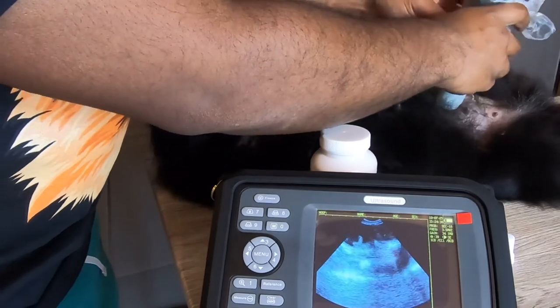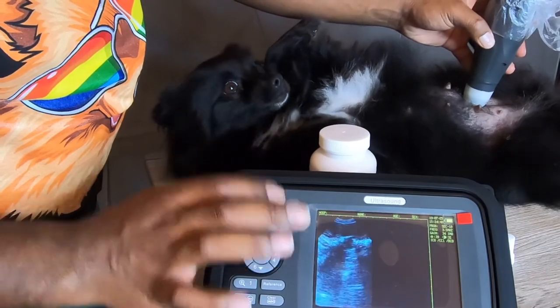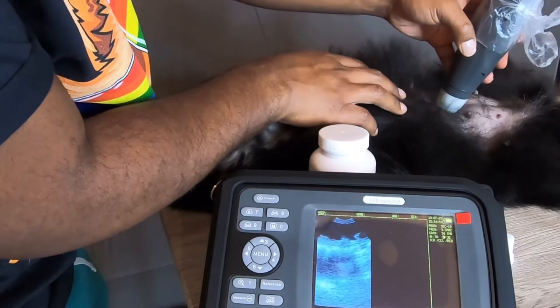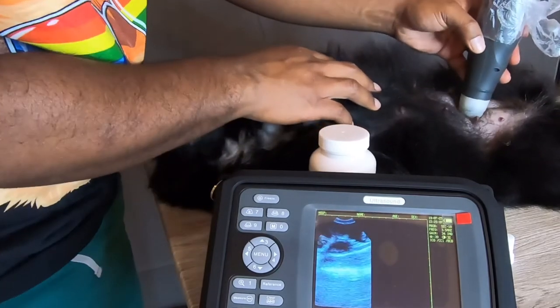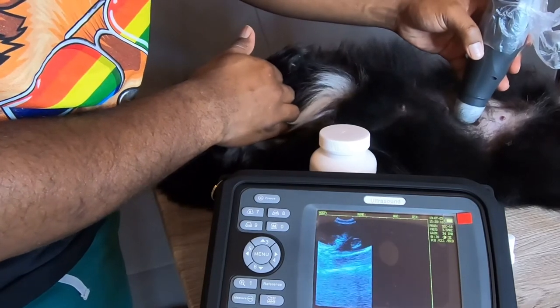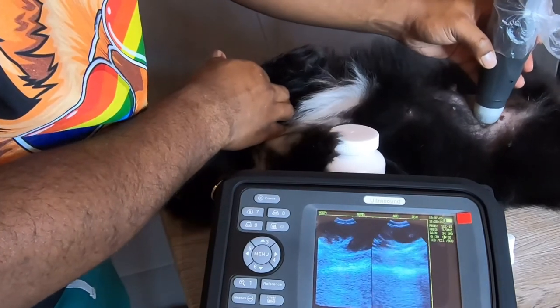Stay still. Stay still, baby. Don't move for daddy. And then you can do split screens. And once I get a good view of one, and her stomach, your stomach has to be shaved. Her stomach is not as shaved as it was before, too. And I'm not gonna shave it again. So that's a good one. Don't move. She moved anyway. But then you could do the split screen and you could try to catch another one.